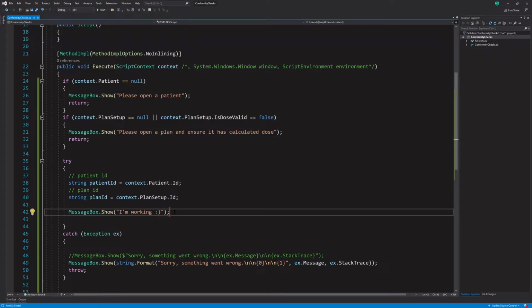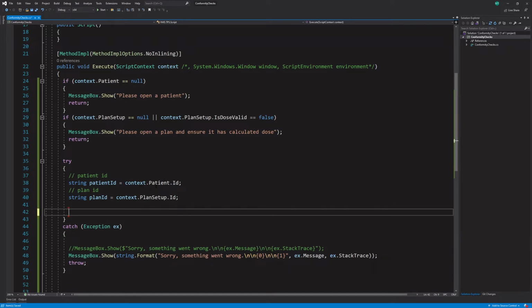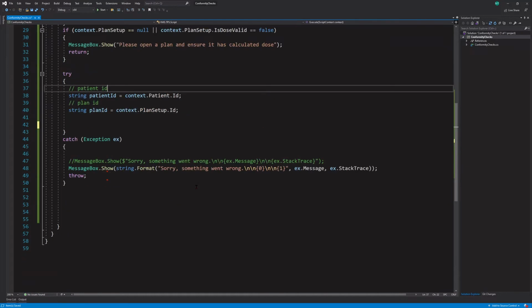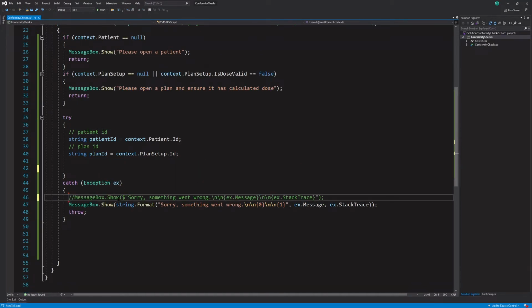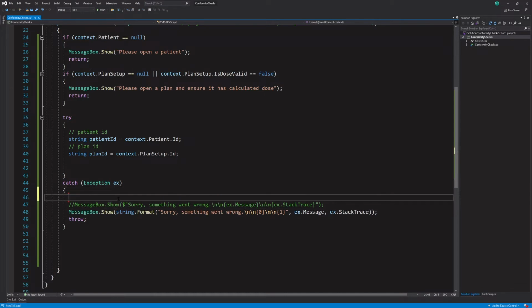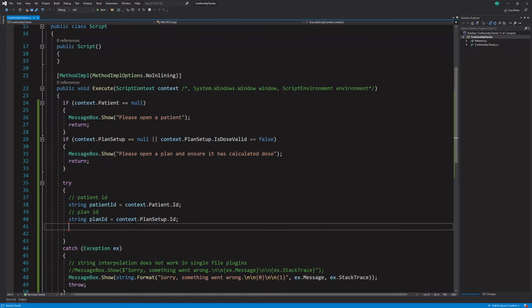We don't need this anymore. We've got the patient ID, so we can display that, and then we've got some checks. Actually, let's write a comment here: String interpolation does not work in single file plugins.